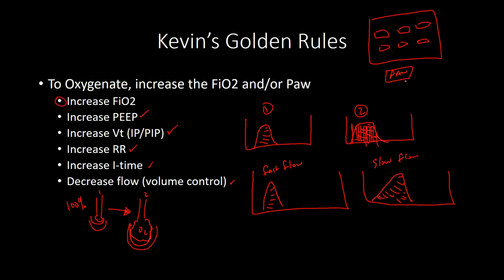I want you to set whatever settings you want. Set it for a normal patient. Then adjust the PEEP up and down, and watch for 20, 30 seconds with each of these changes to see what happens with the mean airway pressure. Then drop the PEEP back down to where it was, let it come back, then increase the tidal volume and change all of these parameters, and watch what happens to the mean airway pressure.